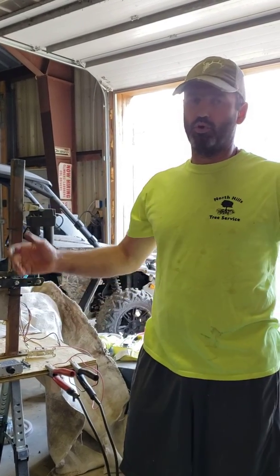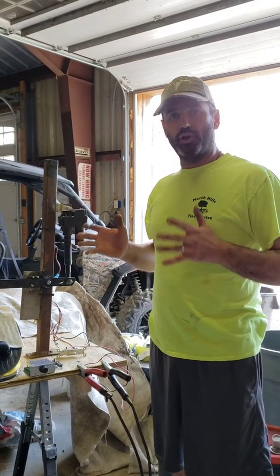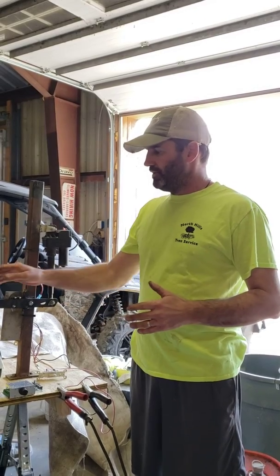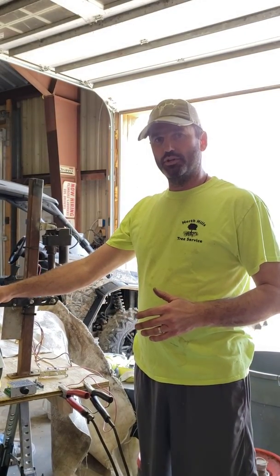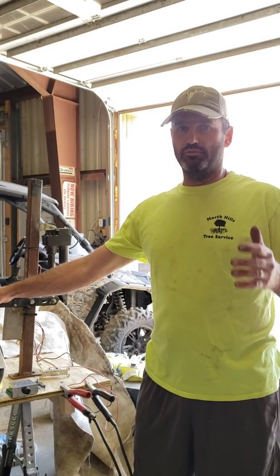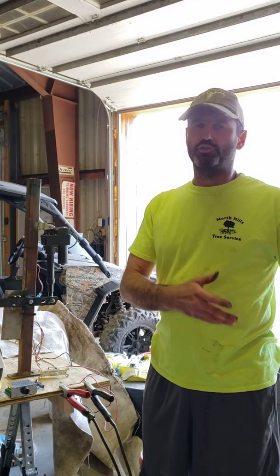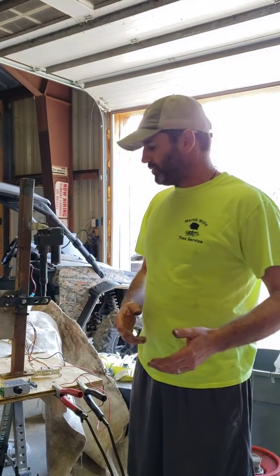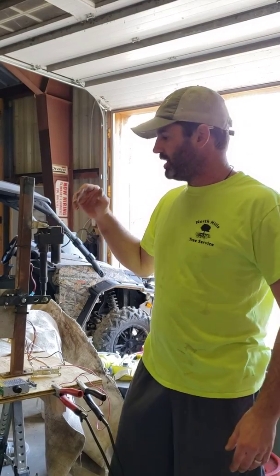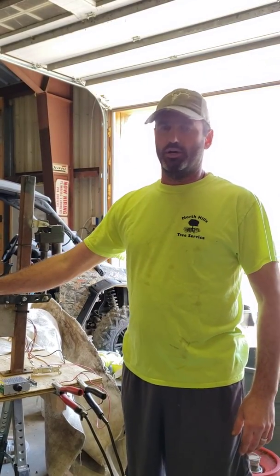Hello America, or the world for that matter — anybody that will listen. I was greatly inspired by an article I saw on Fox News yesterday about the University of Florida attempting to make a very inexpensive ventilator using PVC and parts from a sprinkler system to regulate their air. It got me thinking last night, so I came here to my garage this morning.